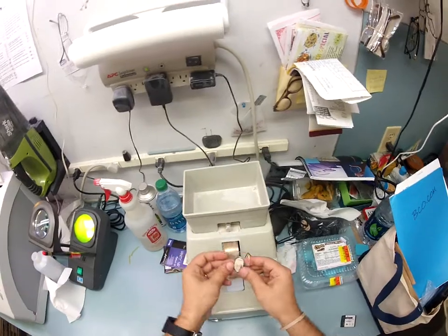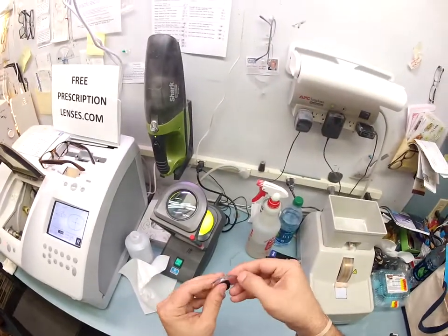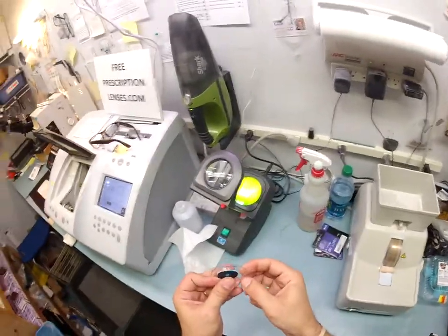So I'm going to put what's known as the safety bevel. I go around the outside of your lens, and you can see this white powdery substance that I'm scraping off the edge of your lens. I do this so much I've worn a V-shaped bevel into my thumbnail.